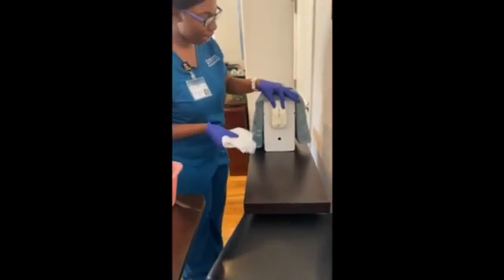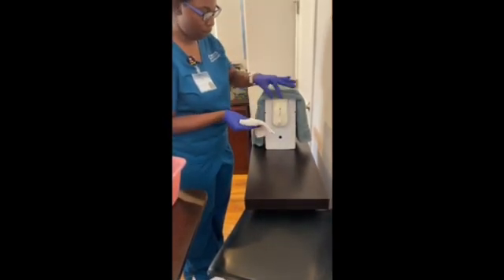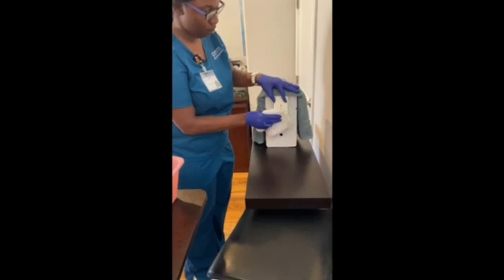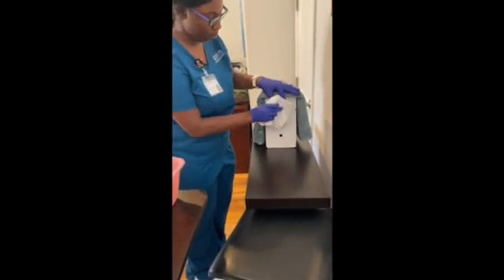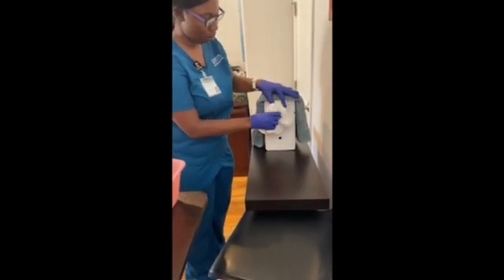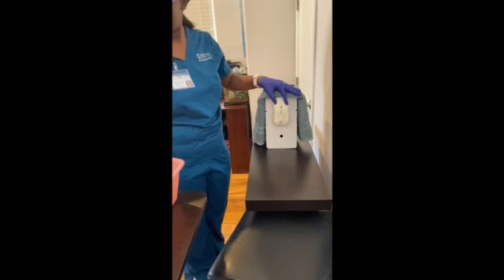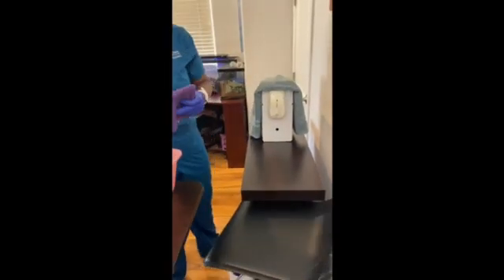Now we will dry patient. During this time, I locate the patient's urinary meatus. In the laundry bin. And right down the middle.